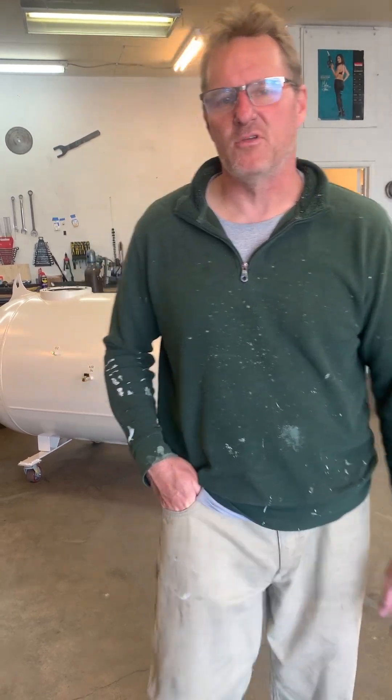This is Dennis with Do-It-Yourself Hyperbaric Chamber. I wanted to give an update that we're almost done with this one. I've got a couple more pieces to put on, but I just wanted to show you our progress. So let me show you.